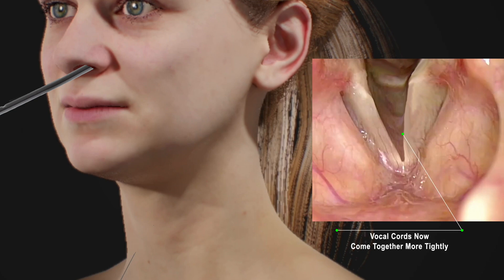Filler materials used for this purpose include fat, collagen, and hydroxyapatite. After injection, the needle and endoscope are removed.